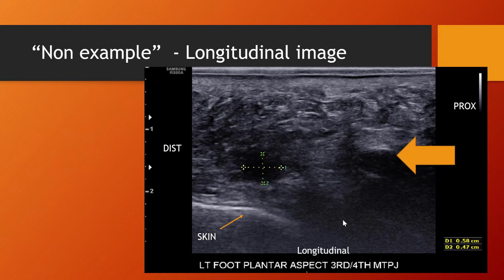There's the shadow from the intermetatarsal ligament. So here would be the location of the nerve and the neuroma. We don't tend to get neuromas distal to the metatarsal head. The web space is at its widest in this region, which is between more the proximal phalanx, and we just don't suffer compressive effects at that level.